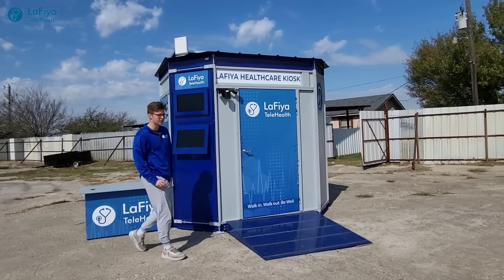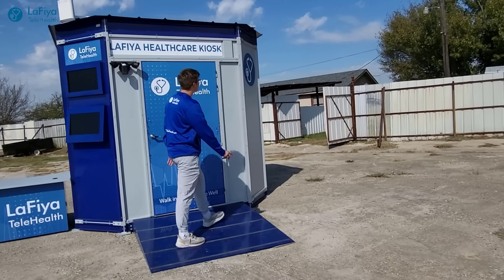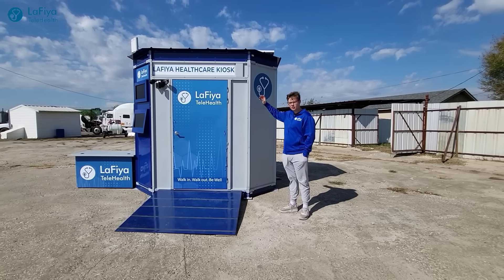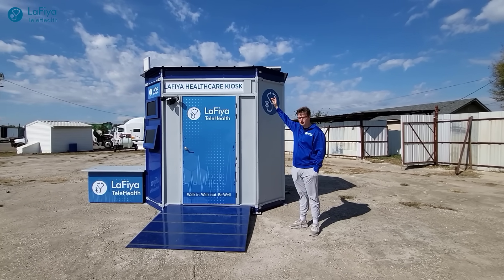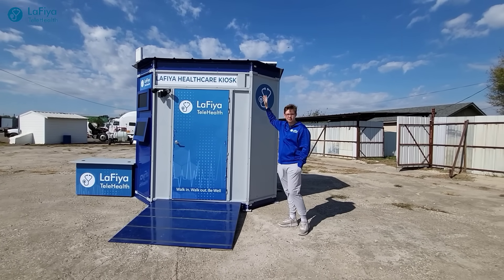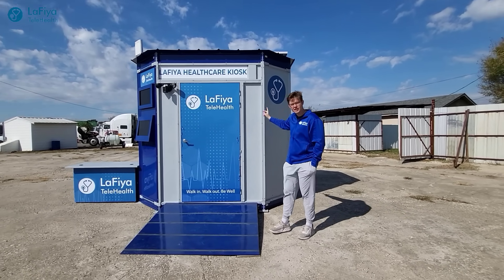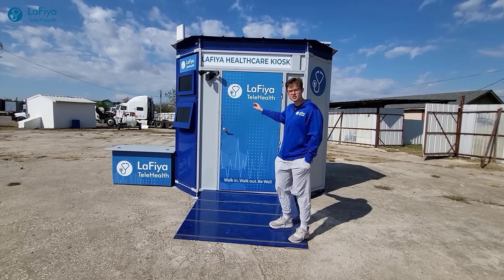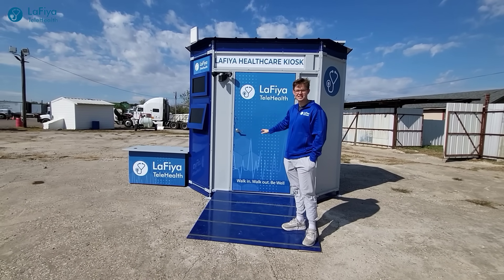On this side of the kiosk, a solar panel dish can be mounted. It's important to note that this kiosk is fully powered by the solar panels on top of the roof. These solar panels are connected to a battery, which is then connected to an inverter, which powers all of the screens and medical equipment inside the kiosk.